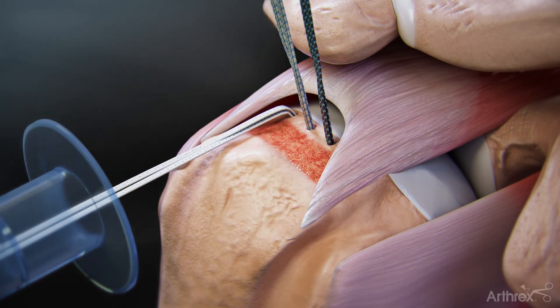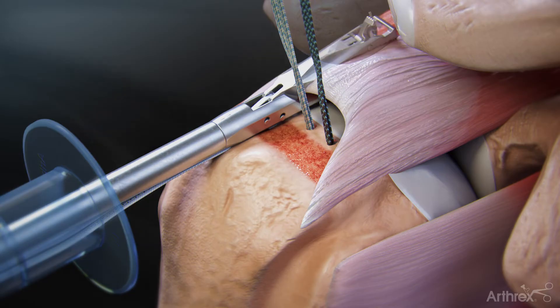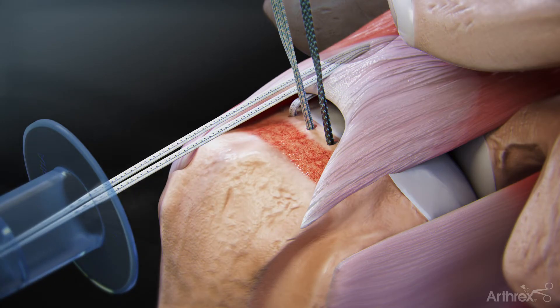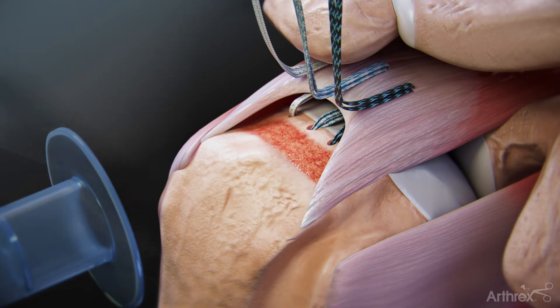Load the joined FibreTape tail from this anchor into a Scorpion Suture Passer and pass the tail of the FibreTape through the rotator cuff, passing both FibreTape limbs at once. Once passed through the cuff, retrieve the FibreTapes from the percutaneous portal used for anchor insertion. Repeat these steps to pass the other sets of FibreTape with a Scorpion Suture Passer.